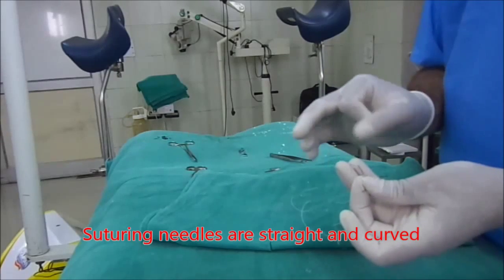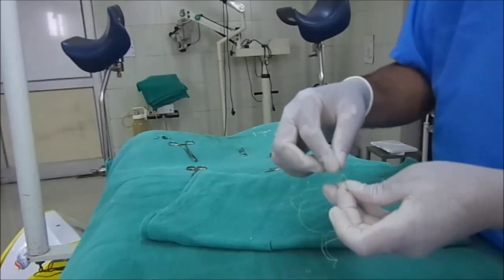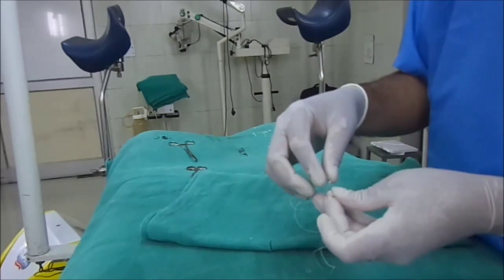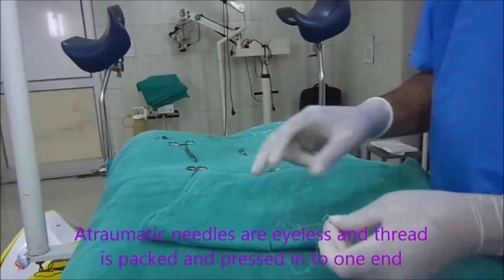An atraumatic needle does not contain this eye — the thread is inserted at one end, and when it is passed through the tissue there is less trauma.